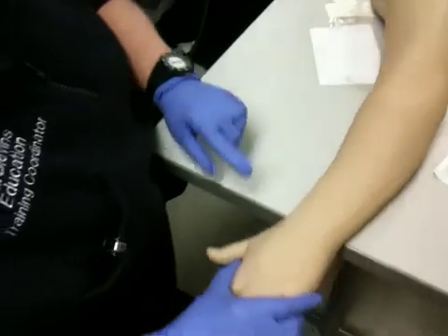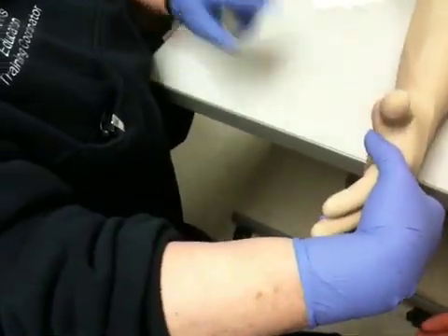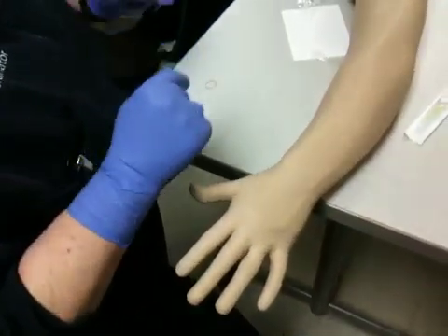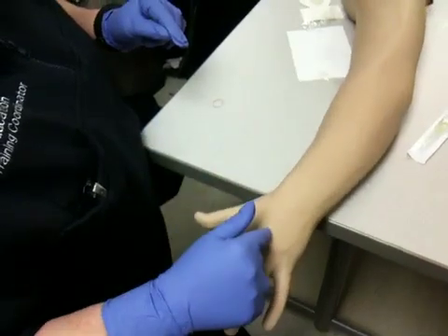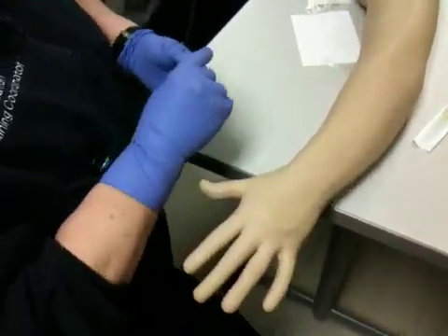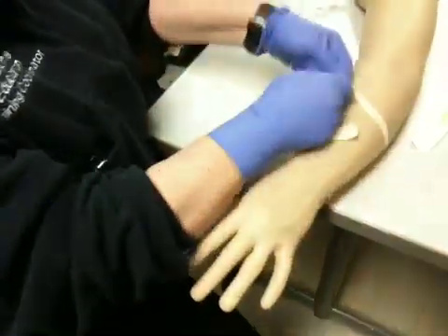So what's the first thing that I want to do? Clean it. Well, I want to look first, correct? Look to see where I think a good place may be. Since it is a medical patient, where do I need to look first? In the hands. Correct. She's got some pretty good ones down here. So where am I going to put the tourniquet? Two inches above.